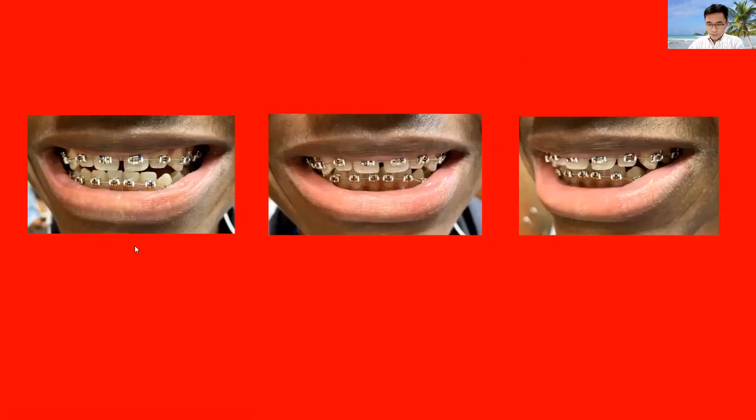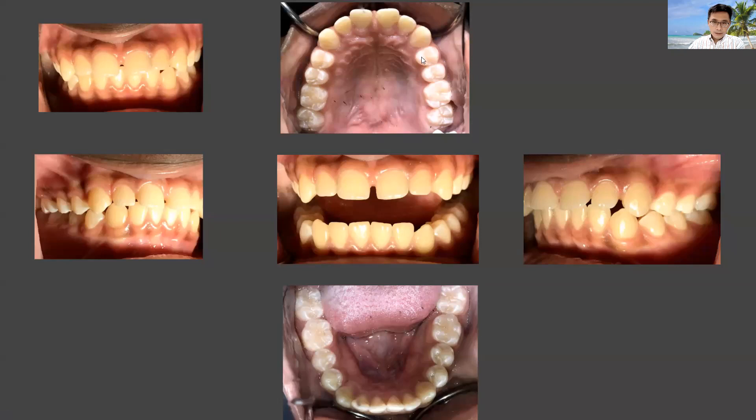Here is the intraoral photo of the upper arch. Teeth numbers 5 through 10 all have a spacing problem. The bottom teeth appear quite straight, which is a good thing. We only have teeth 24 and 25 a little super-erupted. When you see a case like this, it should be manageable — you align the upper teeth, align the lower teeth, and close all the gaps for a good result.